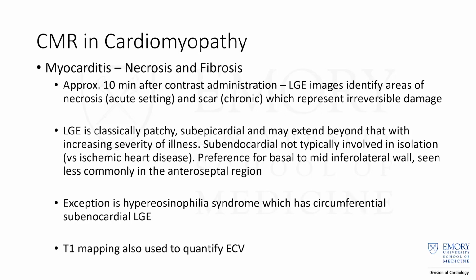The LGE images, so just the thing from this slide is that we'll see this kind of patchy subepicardial gadolinium enhancement with myocarditis. That's the buzzword, the hallmark that we use for this. Subendocardial is typically not involved if you're talking about just myocarditis. Typically it's just epicardial. Ischemic heart disease is the one that you'll see the subendocardial enhancement for. So that tells you the differentiation between those two if you're looking at the gadolinium enhancement images.